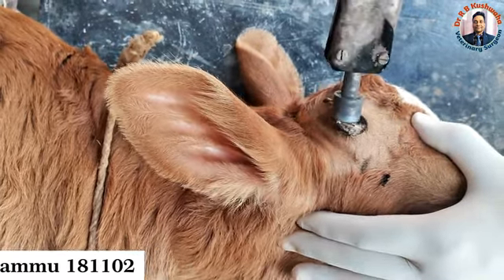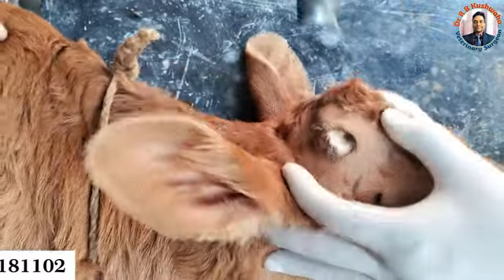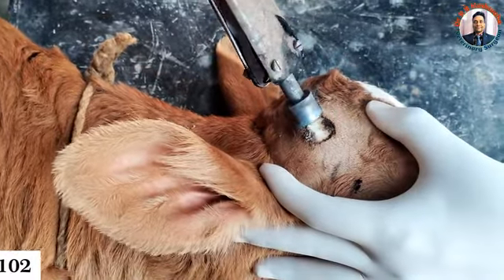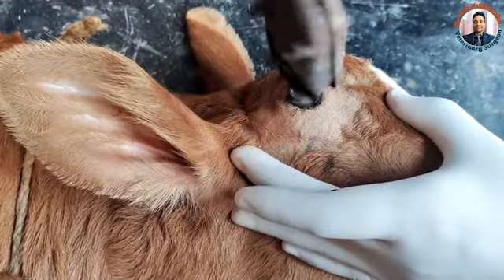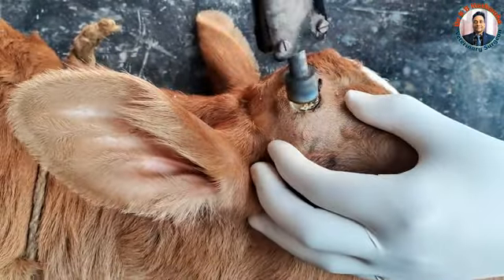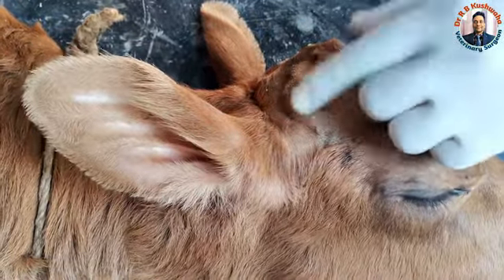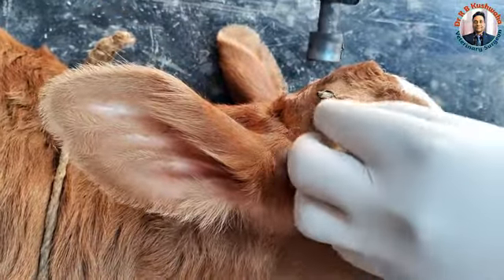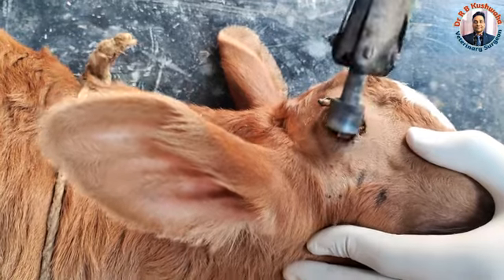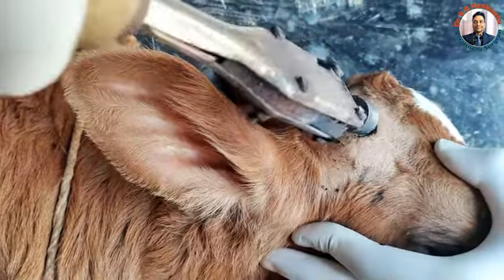We take a scoop to remove the bud. Care should be taken not to apply too much pressure, otherwise there will be depression of the frontal bone. Also, if the animal has not been properly anesthetized, there will be a lot of pain and the animal will struggle.